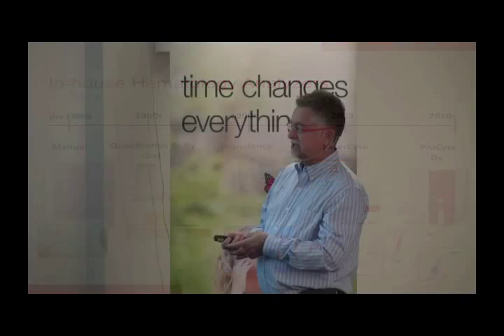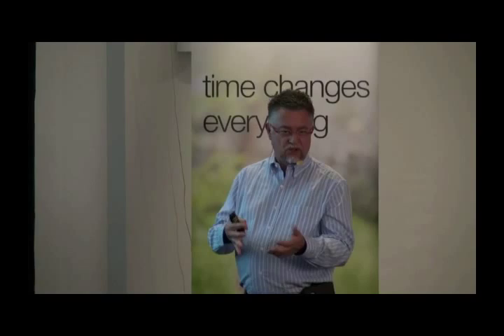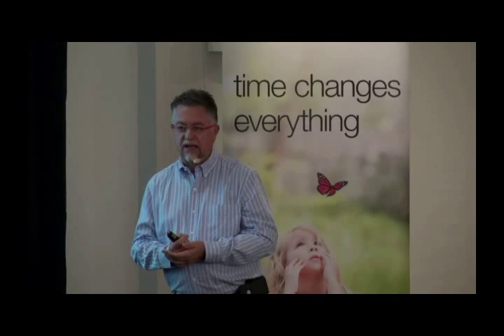So these hemocytometers, we used to use them all the time, and they were a pain in a certain part of your anatomy because you never remember if you were counting the big squares or the little squares, and someone would always come in and ask you a question while you're counting, and you had to start all over again. And then, I tell you, when the QBC machine, or the autoread, at that time it wasn't even an IDEXX instrument, came into play, I started using that in '83 at Ohio State.